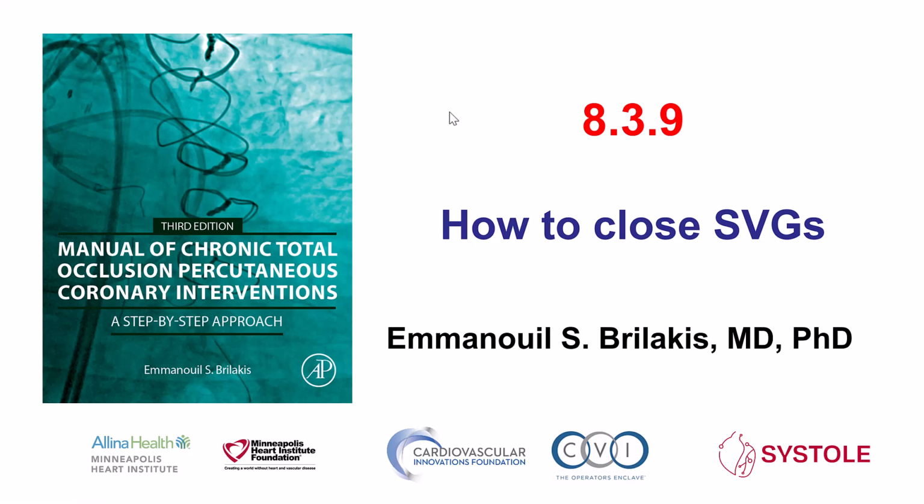Hi, this is Manos Brilakis, and this is video 8.3.9 for the Manual of CTO Interventions. This is a video that discusses how to close saphenous vein grafts after recanalizing the native coronary CTO.